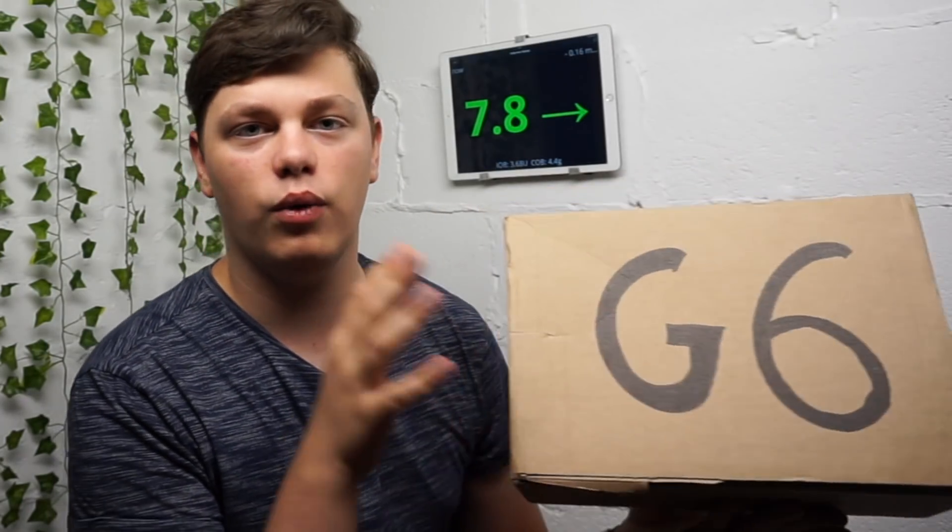By the way, this video is actually not scripted. I usually write scripts for my videos to make sure all the facts are accurate and all the numbers are up to date, but I'm just doing an unboxing so I want to give you my real first thoughts. So this is it. Also, I have no relationship with Dexcom and I paid for this myself.